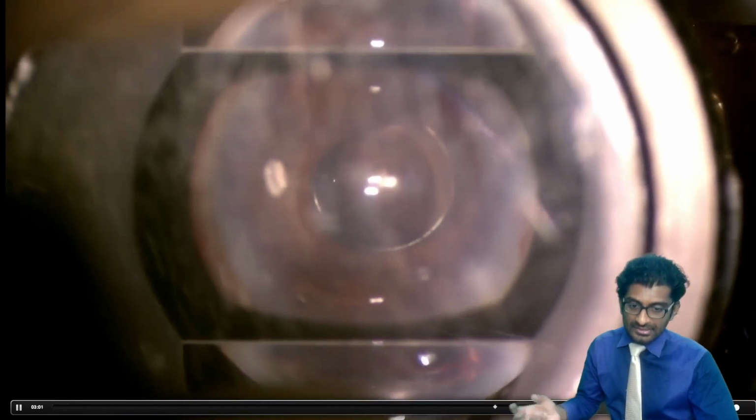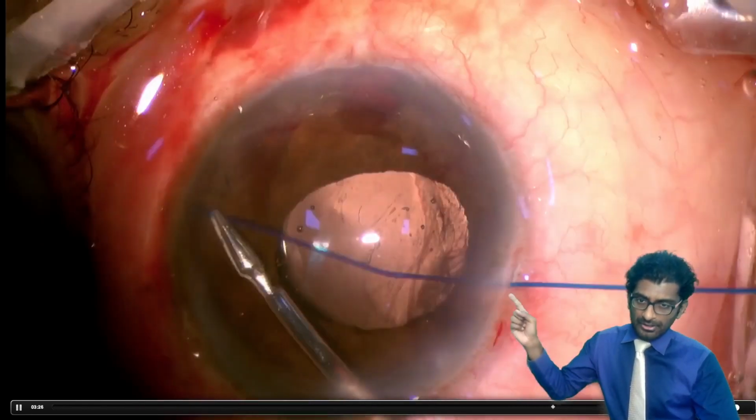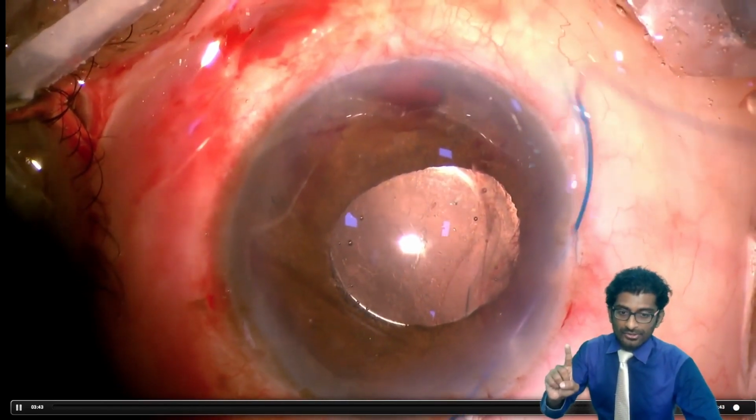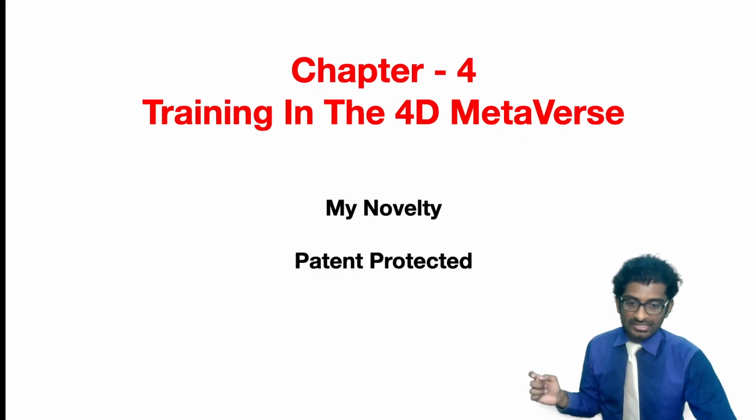Now I took the direct gonioscope away and went to an indirect gonioscope. Saw whether I'm going in for a false passage. Yes, the suture was going towards a false passage. Aborted the procedure before anything drastic could happen. So direct gonio with an indirect gonio really has its role. Make sure you use it, especially for suture gap in your early stages.